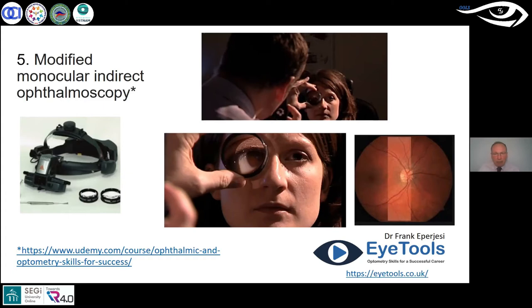In most cases I can see the macula, the fovea, and the optic nerve head all in one view. I want to make sure there's no optic nerve head disease that I might miss. It's moderately magnified — not as much as when I'm up close with just my direct ophthalmoscope — but it's enough. It's the wider field of view that really helps me. If I spot something of interest, I can then look with just my direct to further investigate if needed.